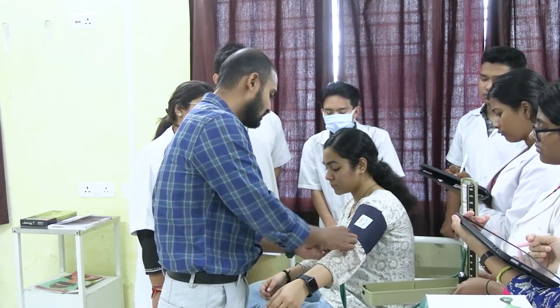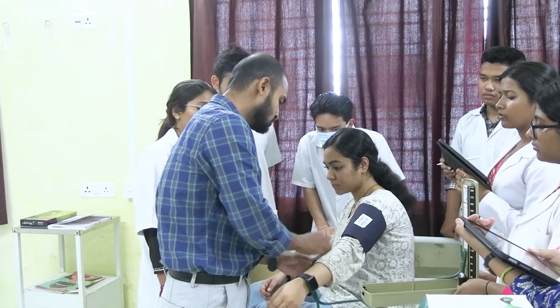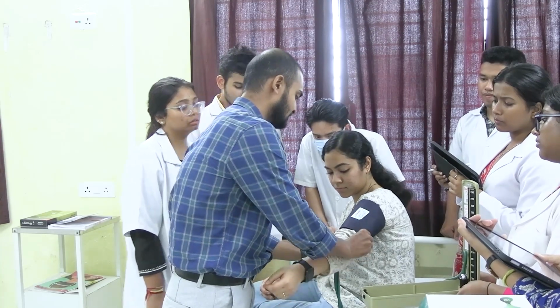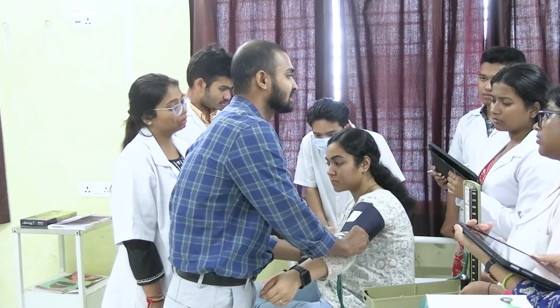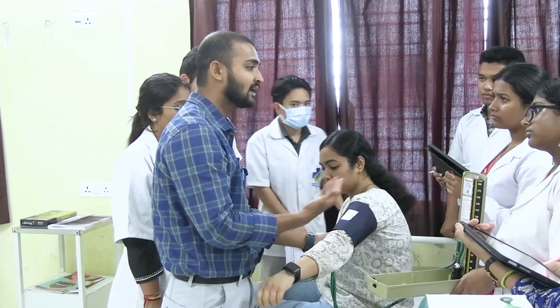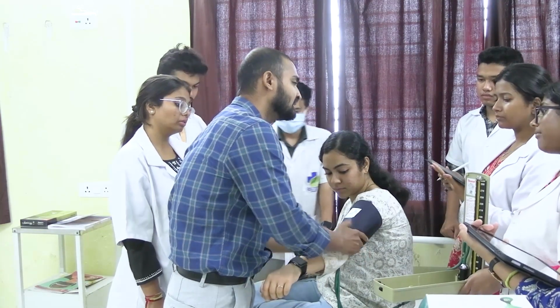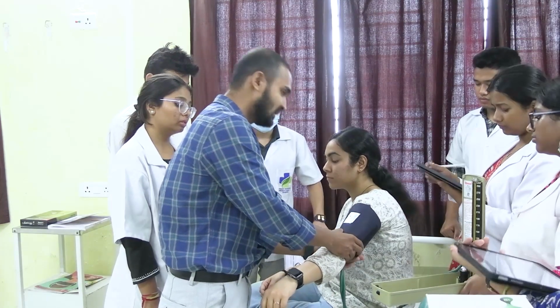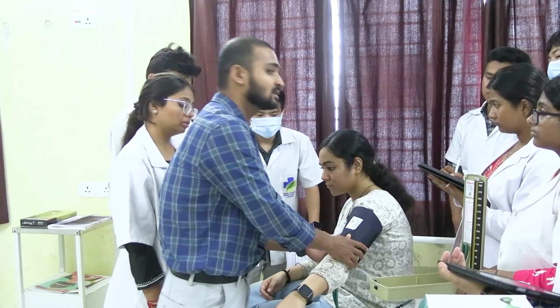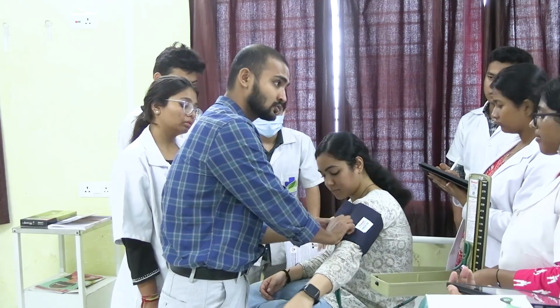Now we have placed it above the antecubital fossa, and this tube should be medially and directed where? Inferiorly. In one book it is written inferiorly, and in another book it is written anterolaterally. So I am putting it medially and inferiorly. And this cuff should be not too tight, not too loose.